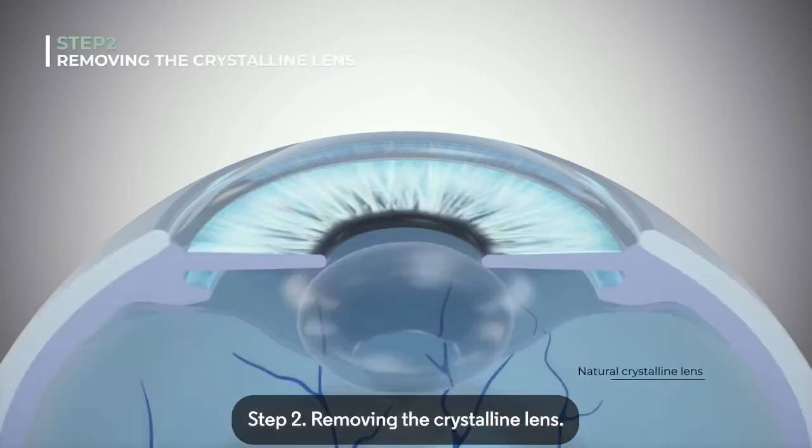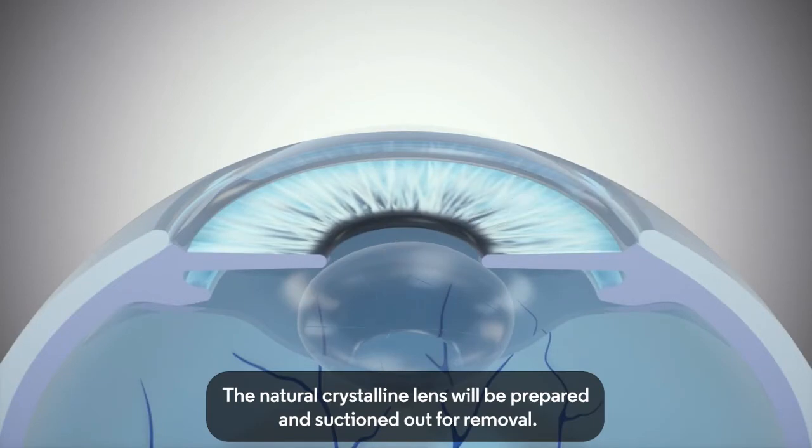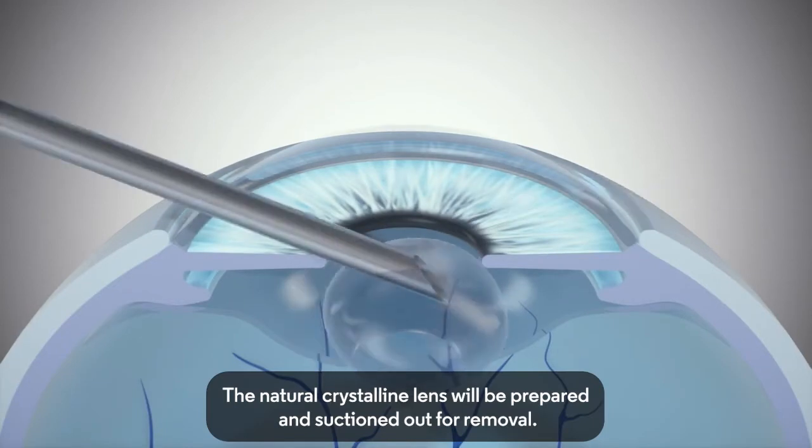Step 2: Removing the Crystalline Lens. The Natural Crystalline Lens will be prepared and suctioned out for removal.